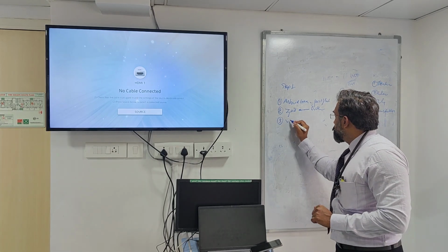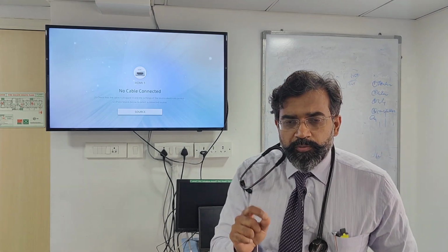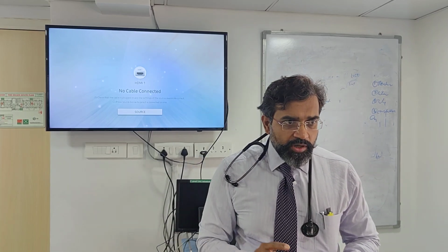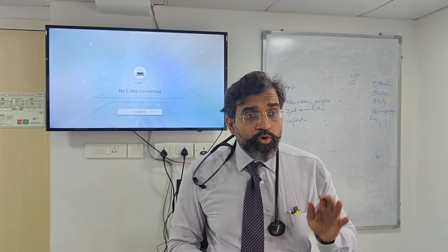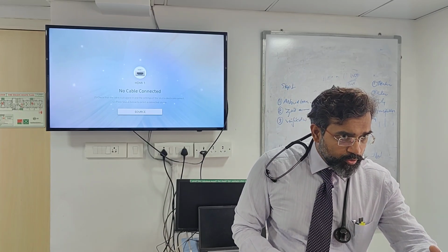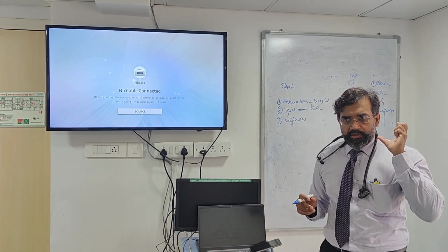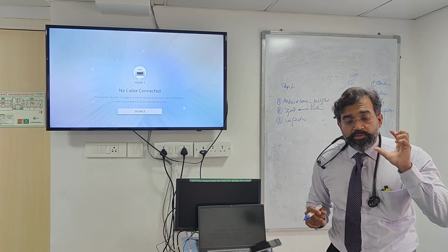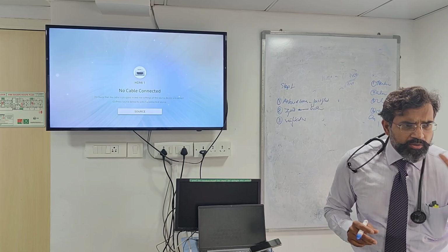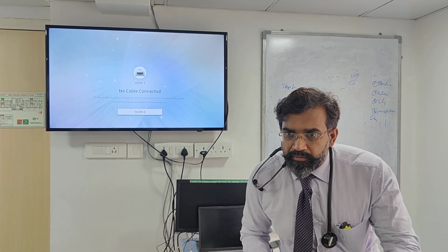Verification of connections. Till now we were just looking at what the connection should be and where the connector should be. She showed the orientation should be perpendicular. You have a central line and a perpendicular. So you should use the most distal tip to put in the thermodilution set, not the one here, the one here. The first sensor has to be at the distal port. Usually the brown port is the distal port.